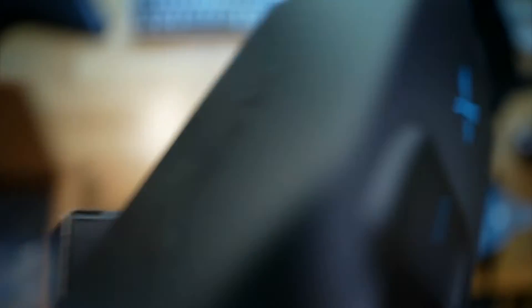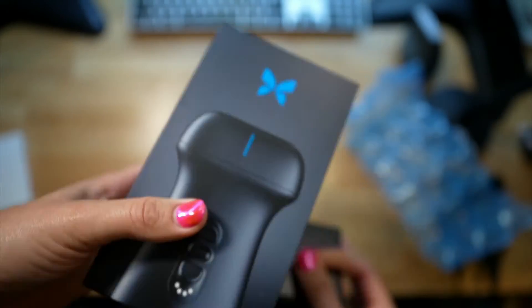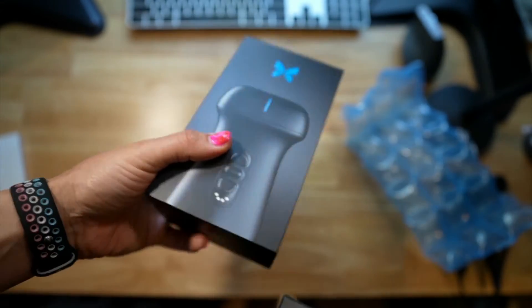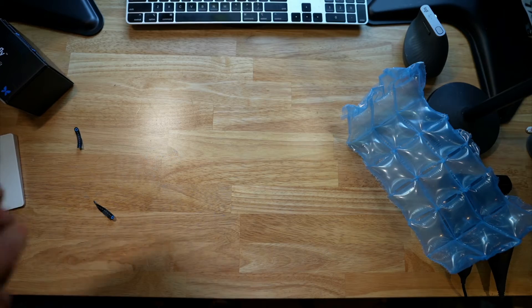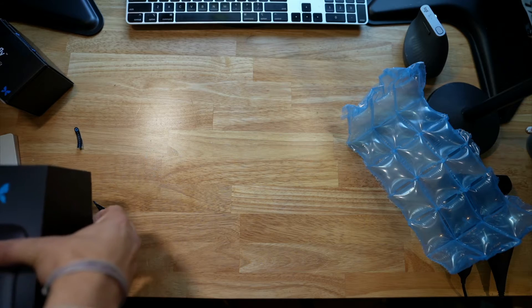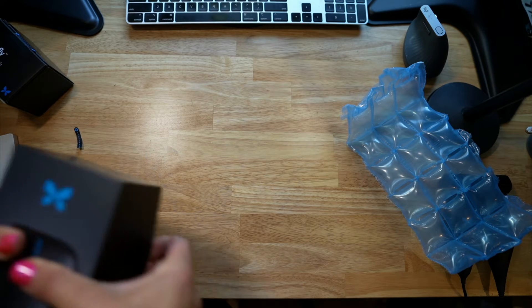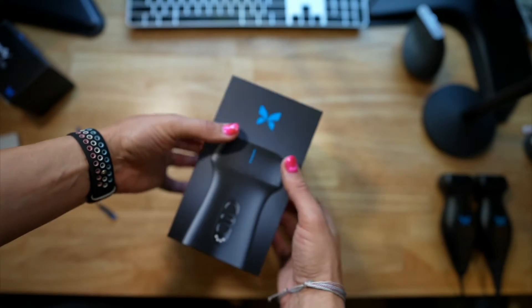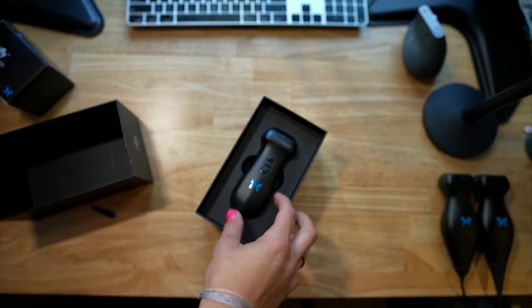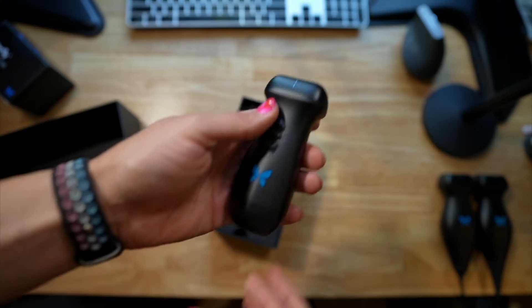The box is definitely smaller than the other box, the one that the IQ Plus comes in. And thank you to the folks at Butterfly, who were nice enough to give me this probe in exchange for my thoughts on it. And this is the probe — it's kind of sweet looking.